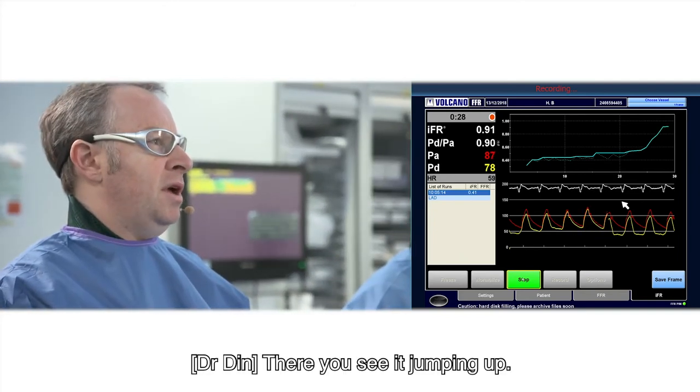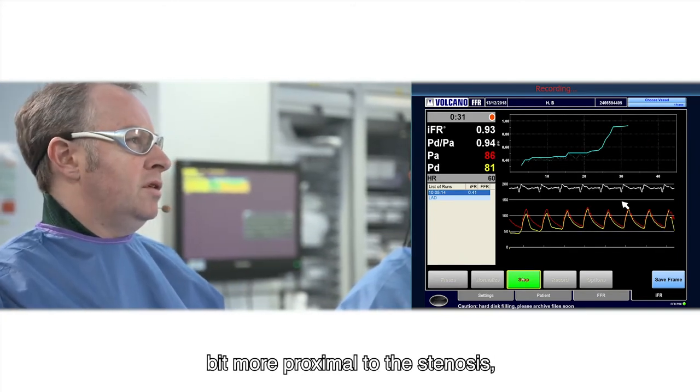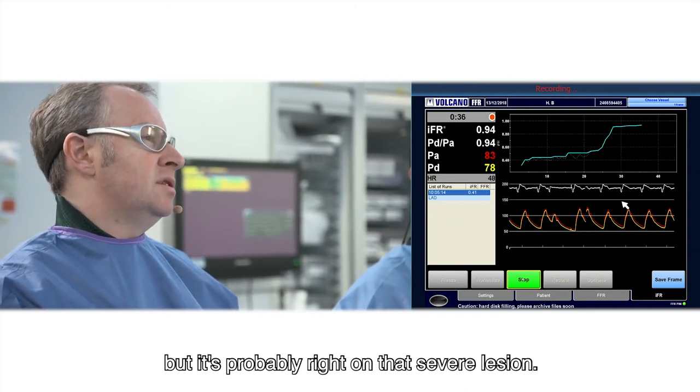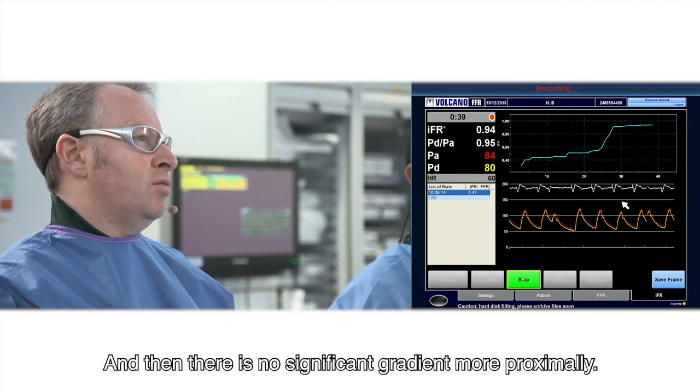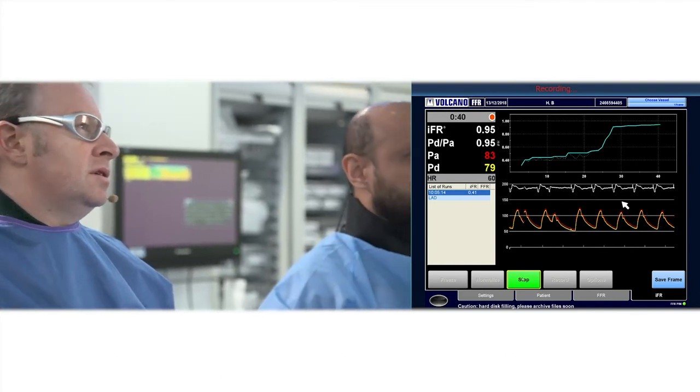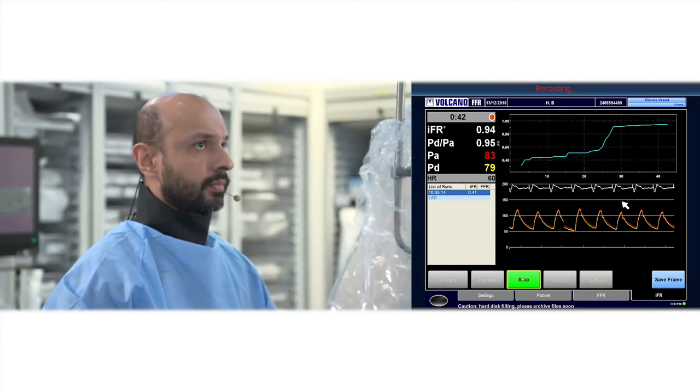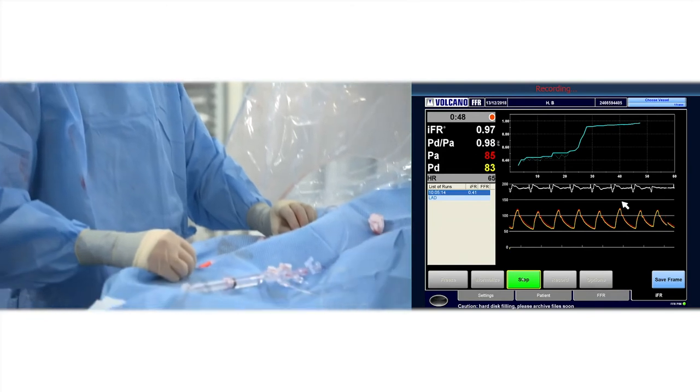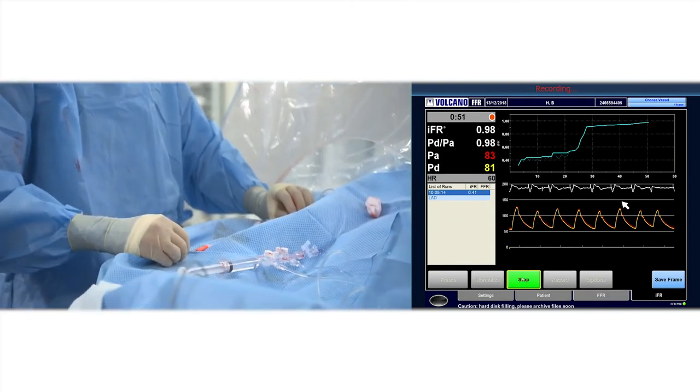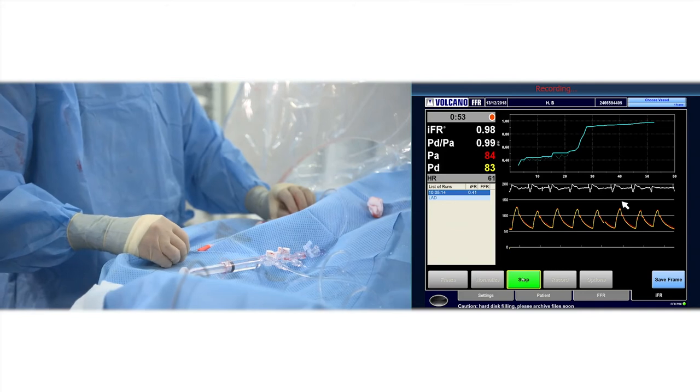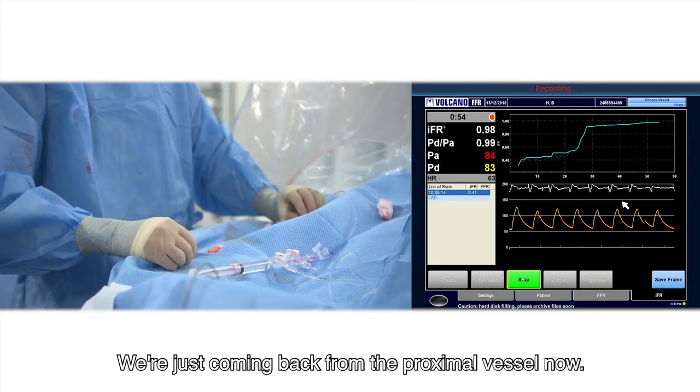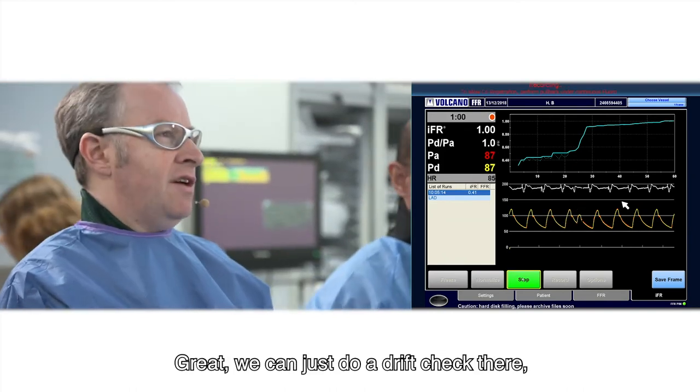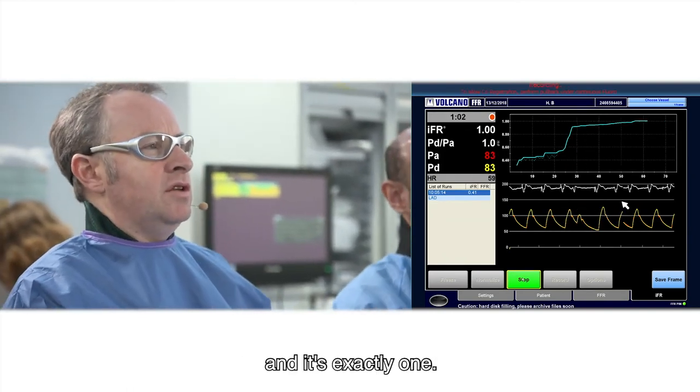There you see it jumping up. A big jump up there, which actually is a little bit more proximal to the stenosis, but it's probably right on that severe lesion. And then there's no significant gradient more proximally. We're just coming back to the proximal vessel now. Great, we can just do a drift check there, and it's exactly one. So we're very happy with that.